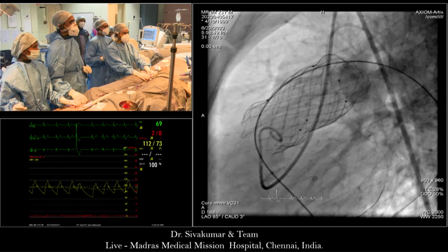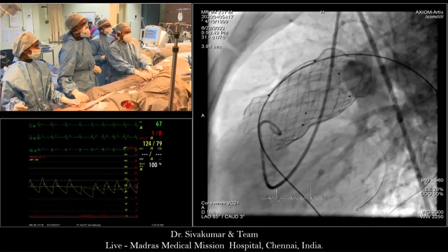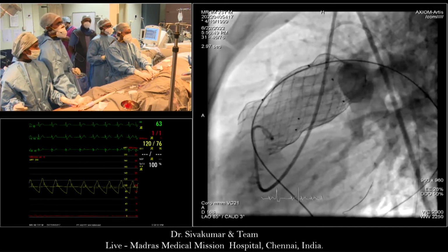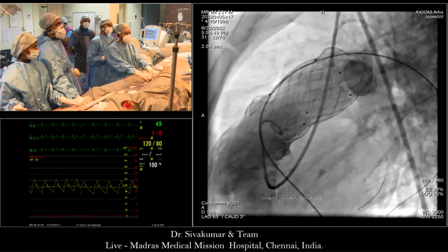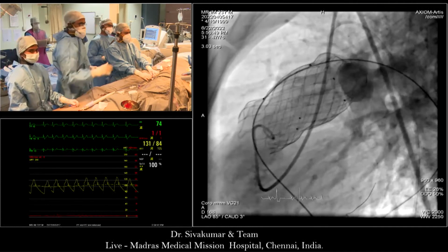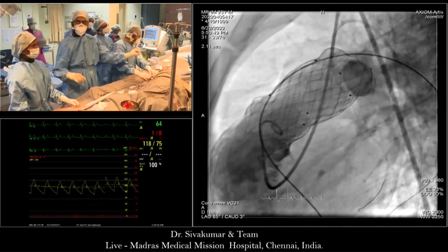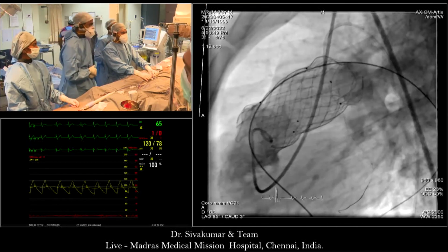Shaq, the position looks okay for me here. If you look at the lateral and where the RPA is, where it's going into the picture, the distal flare is in an absolutely perfect position. Tell that again, Shaq. The distal flare is? So come to LAO cranial. If you look at AP, we haven't got a pointer here, have we? I can't see your pointer.